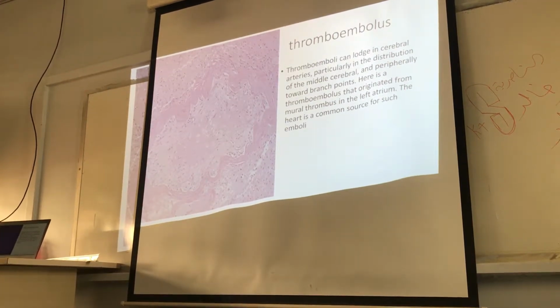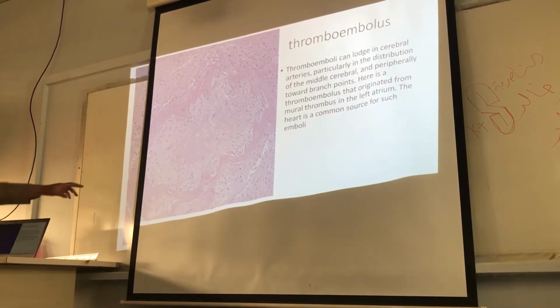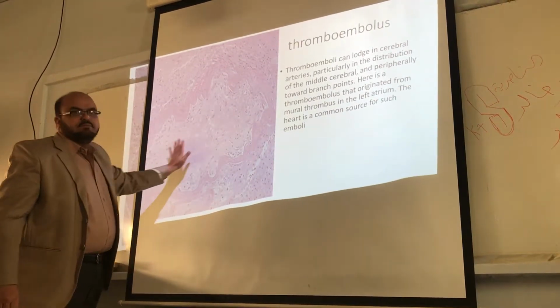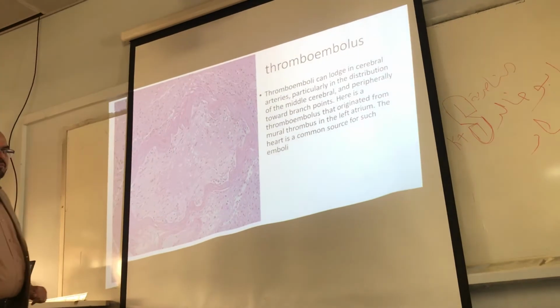Microscopic section. This is the vessel you have. This is the vessel and this is the thrombus.